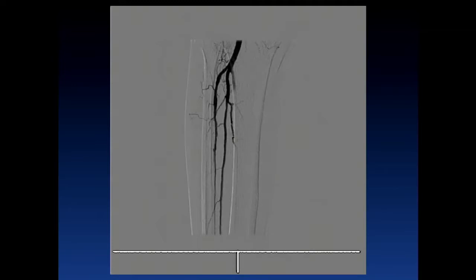Yeah, that's certainly a possibility. And I mean, I used a glide wire M, which could certainly go into some small branches and poke into them. I guess what I would say is after the initial balloon angioplasty, there was no perforation. It was only after the subsequent angioplasty. I wonder if there was a calcified nodule in that area that then just resulted in perforation locally.